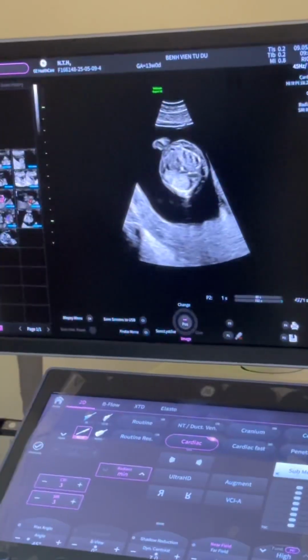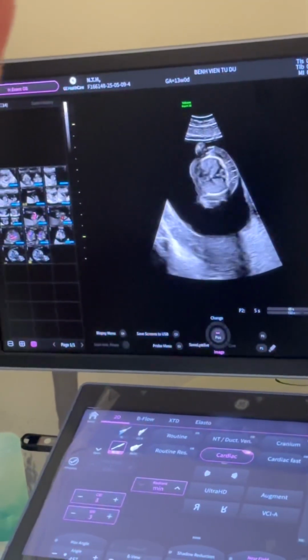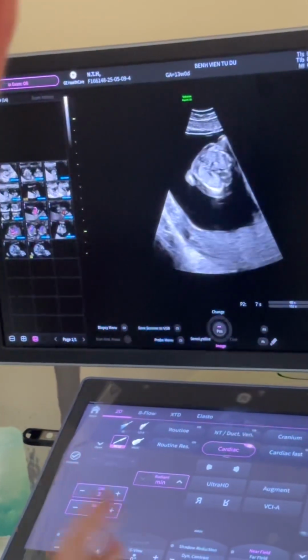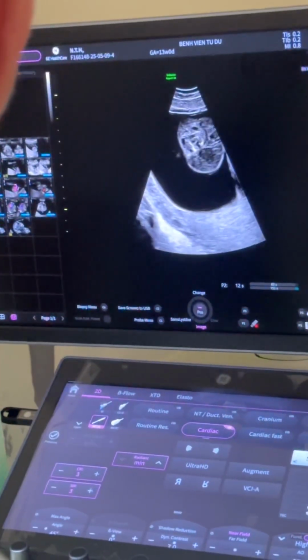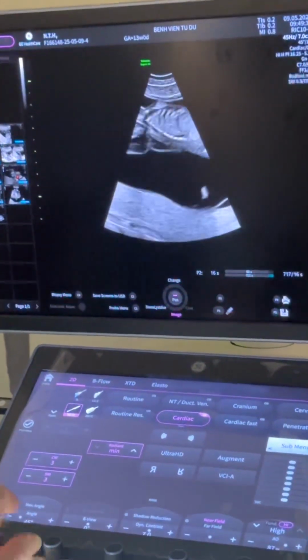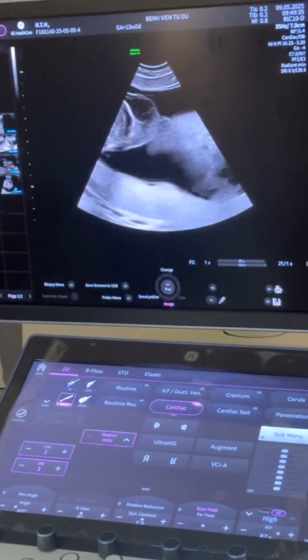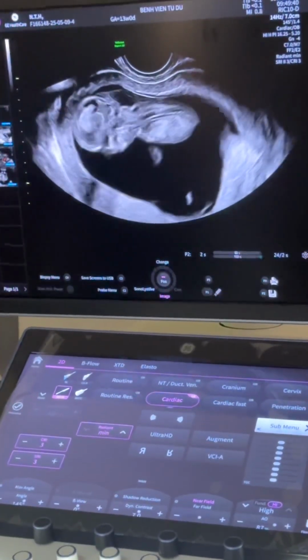Yeah, one case of trisomy 18. You have one. Yeah. And how many weeks? That's fine, we can see her. Happy to see her. Yeah. Do you want to try? Yeah, yeah, of course. Cái này vòng 4 chuyện không, nhưng mà cái này cái thứ hai, vòng 4 cái này thứ ba. Viện chính nó nói đưa qua thôi. Thì cứ coi xếp hàng từ từ thôi. Người ta nói như vậy.